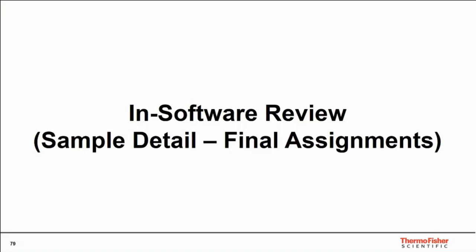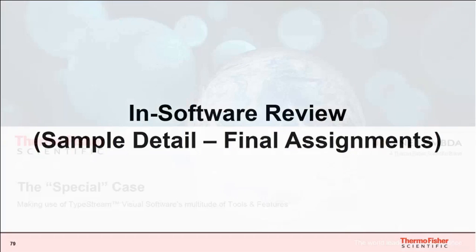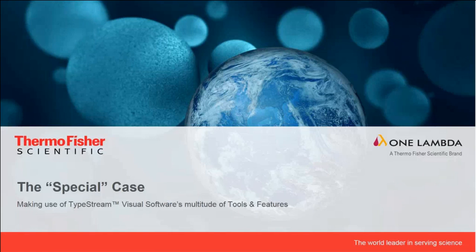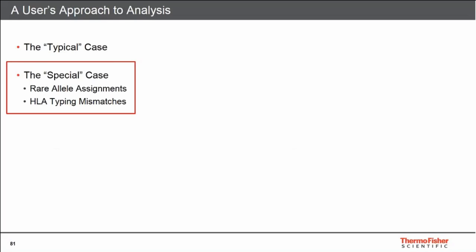All of those steps — starting from the home screen, creating the session, assessing the session from the session summary screen, and reporting out final assignments — represent what a user does in 90 to 95 percent of cases: the typical case. For the special case — five to ten percent of cases — we make use of additional functionality within TypeStream Visual. The two special case scenarios highlighted today are rare allele assignments and scenarios where we have HLA typing mismatches, meaning possibly novel alleles present in our sample.